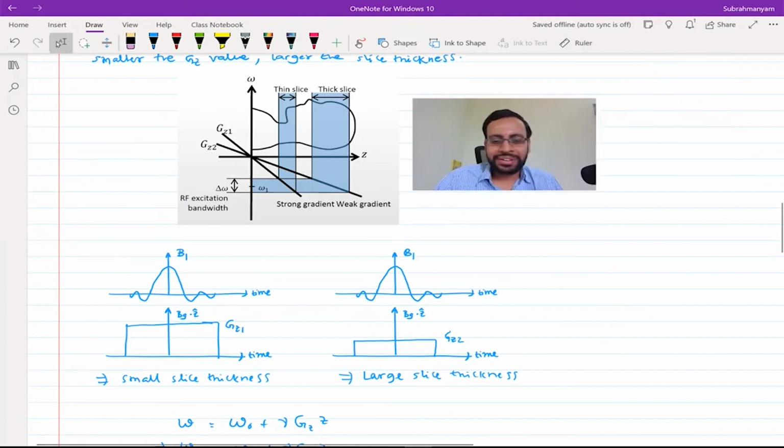If we take a thicker slice, everything would resonate at a similar frequency. So what is the recording that we will get? It would be for the complete skull, a three-dimensional recording, in the extreme case you are talking about, right? Yes, sir. In the extreme case, everything gets averaged over a very large region. That's what you are getting there.